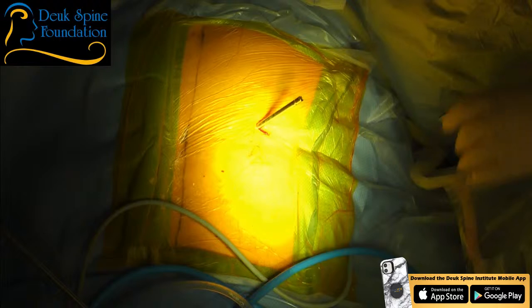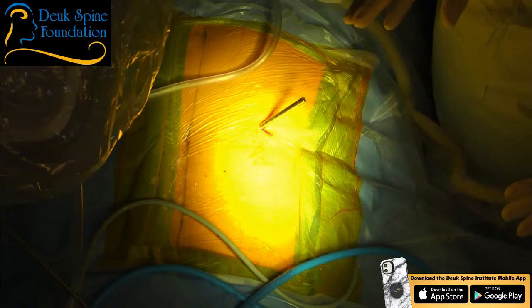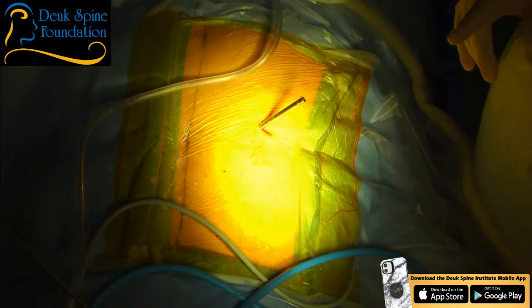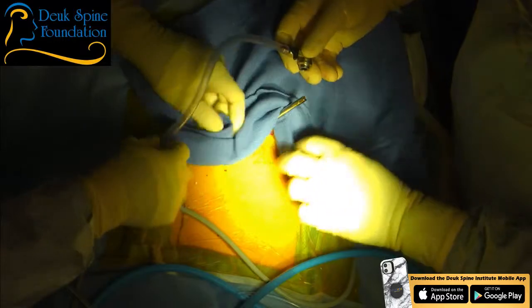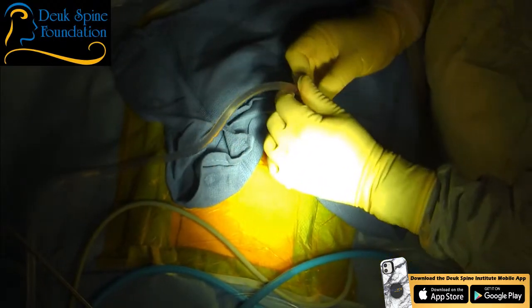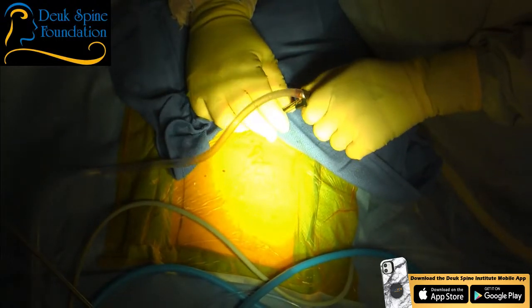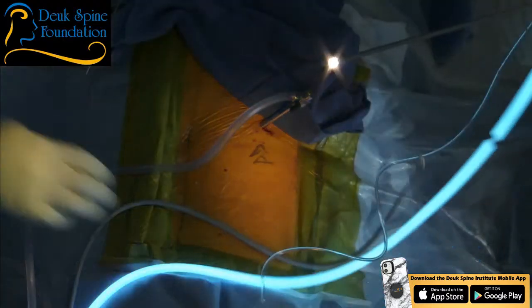So I don't want to get into a lot of the technical anatomy, but if you just fuse the spine, you will not fix the leg symptoms or arm symptoms. You must decompress and realign. Realignment and decompression are very important. Now, if the patient has inflammation as the cause, then just going in with the laser and removing the source of inflammation in the back of the disc, which is the annular tear, will get rid of the leg symptoms, arm symptoms, as well as the axial pain. That's the pain in their back or neck.